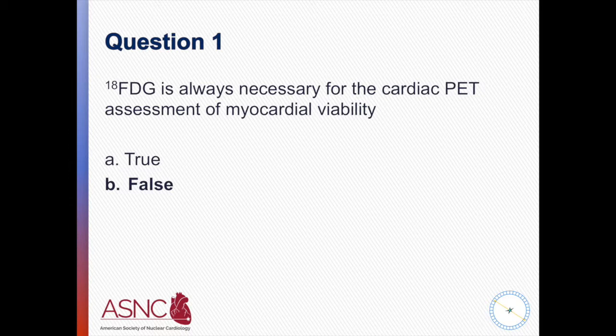beginning with an ischemic evaluation I think is very important because in many cases, patients referred to our laboratory for myocardial viability assessment, the rest and stress perfusion images demonstrate definite inducible ischemia and very normal resting uptake of the tracer, which by itself implies the presence of myocardial viability as well as ischemia. And the presence of ischemia, as we all know, is really the biggest predictor of benefit of myocardial revascularization. So in those cases, FDG is not required to make the decision regarding myocardial viability. The patient can be referred for revascularization confidently based on just the rest and stress perfusion imaging alone.